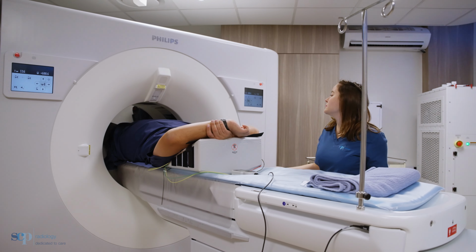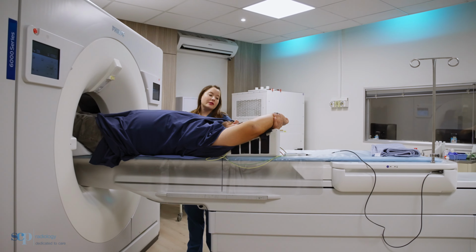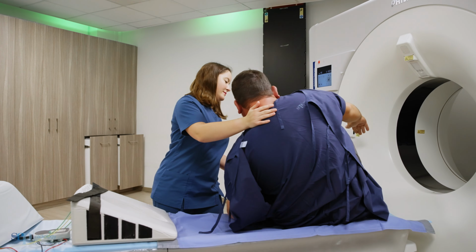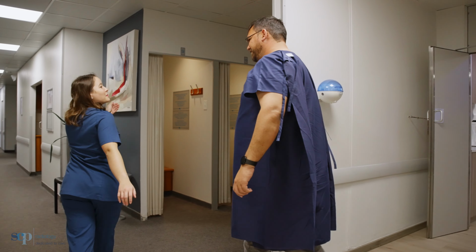Once a patient's had a coronary study, it will help a clinician to direct their management as needed. A repeat study is usually considered in several years if nothing was done, just to monitor progression of disease. Or sometimes if patients have had a procedure performed and they re-present with the same symptoms, then cardiac CT can be quite useful to also assess for complications, in which case we might re-image them sooner.